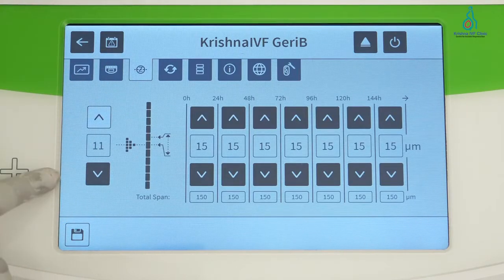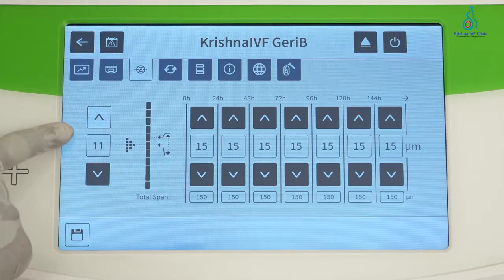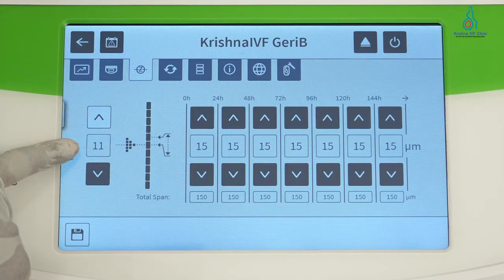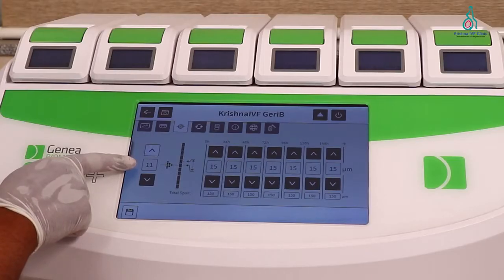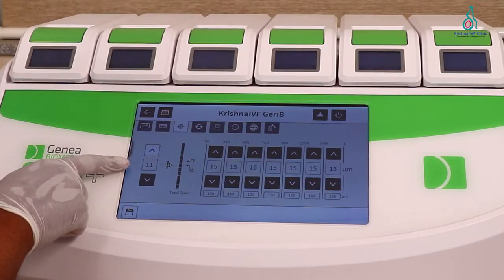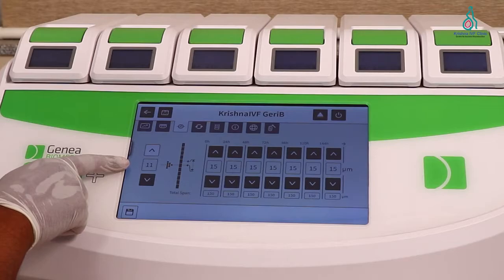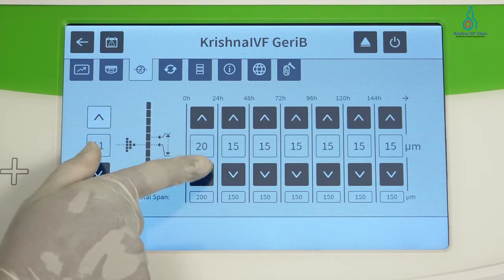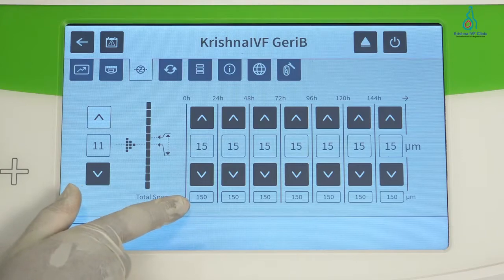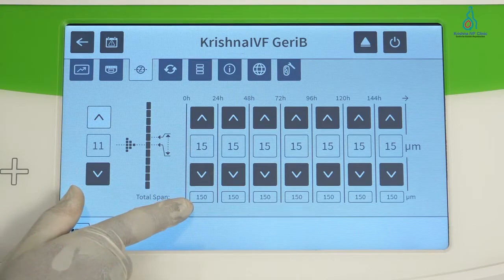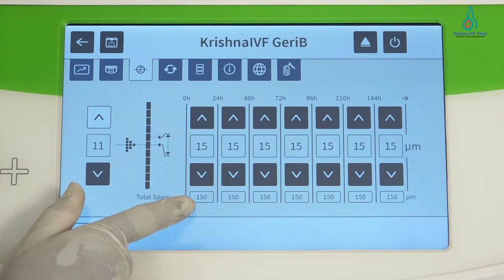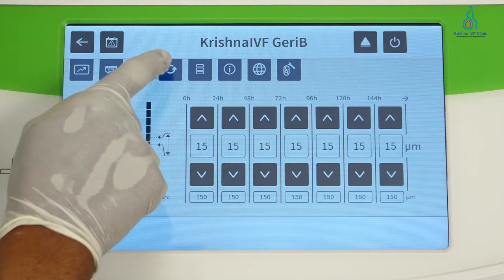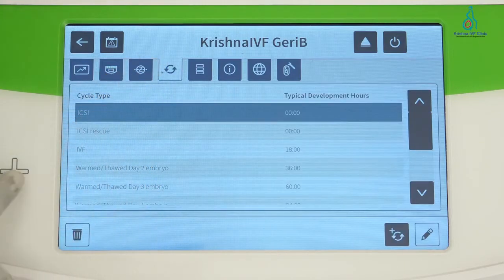Here is the camera setting. The Z-stack span is mentioned here — it is set to 11, meaning it takes 11 images at a time. This is the distance used to take images of the oocytes or embryos; currently it is 15 microns, and we can change it as per our requirement.